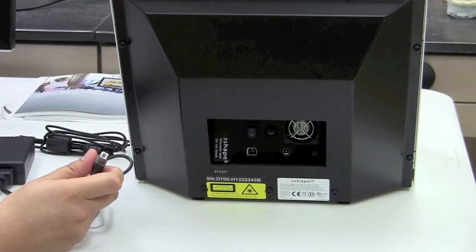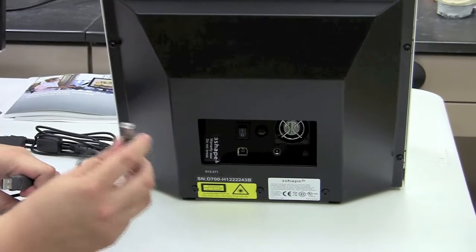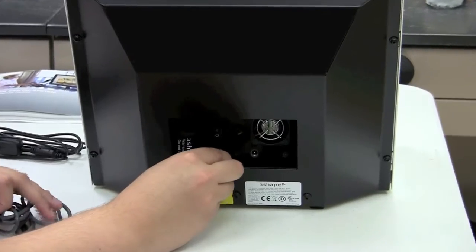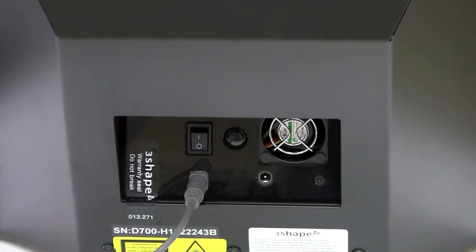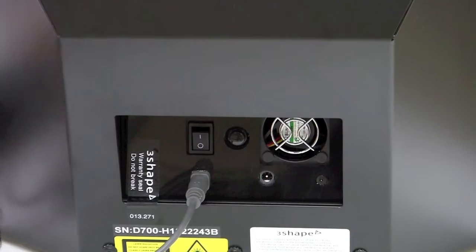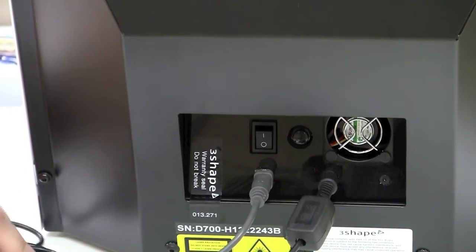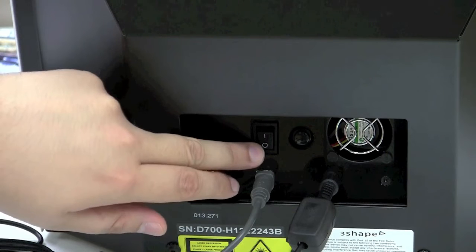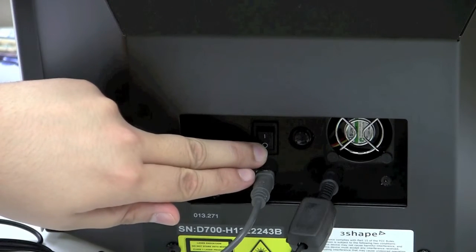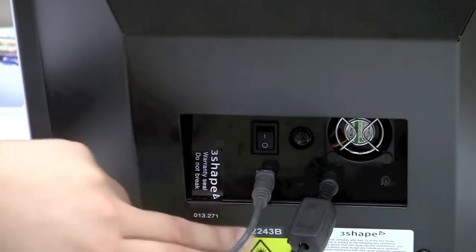The other end is similar to a printer cable that you may be familiar with. Using this second end, plug it into the back of the scanner — it only goes in one way. From the power brick, there is a small power socket adapter; plug this into the power port on the back of the scanner as well. On the back of the scanner — before plugging anything into an electrical outlet — you have the power switch, which should be in the off position, an exhaust fan, the USB port, and the power port.